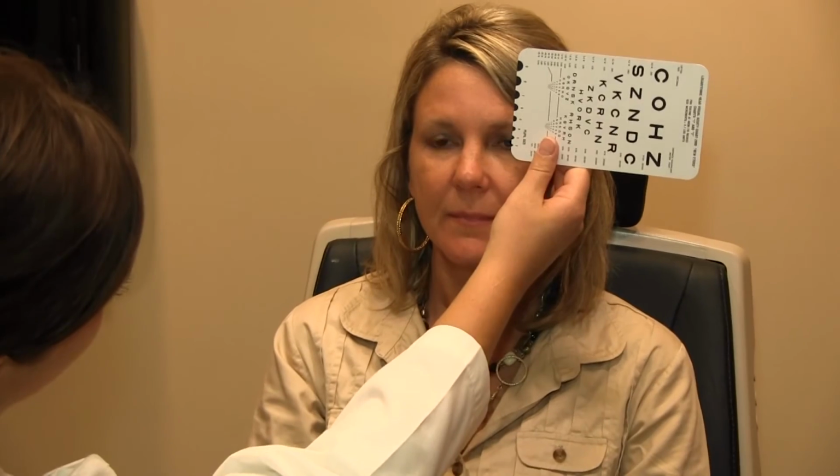This lens is very customizable for pupil size, so it's very important that you take a good look at the pupils prior to ordering the lens. It's important to note whether a patient has small, average, or large pupils, because the pupil size can impact the lens optics: distance, intermediate, and near.